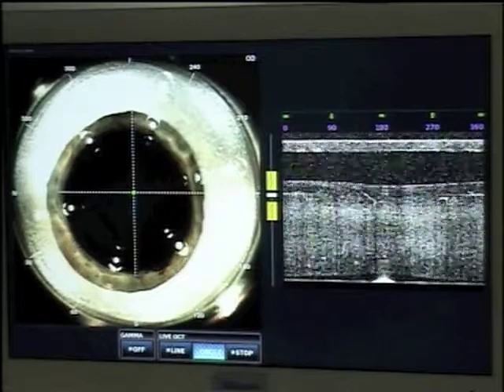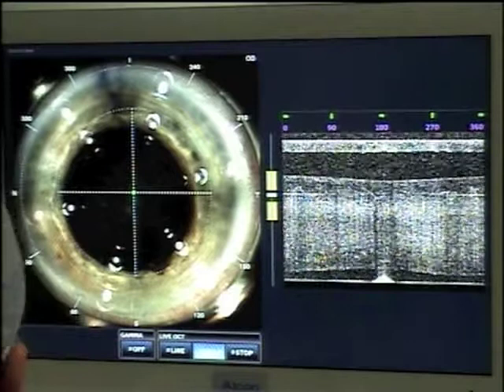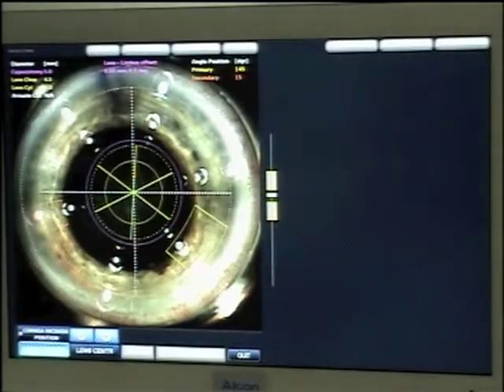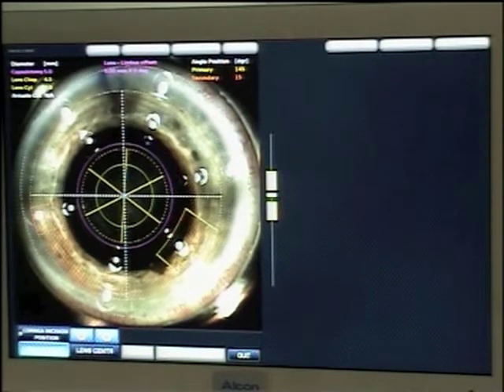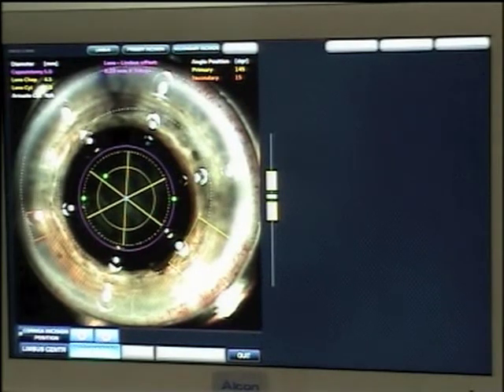Okay, here we go with our case. We're applanating on the patient's cornea. You can see here suction is built up now, and we will adjust first the limbal position according to our plan. And this is done already. Now I'm adjusting my side cut at the 8 o'clock position, taking it out to the limbus. Now my main incision, again, taking it out to the limbus. This is at the 4 to 5 o'clock position.